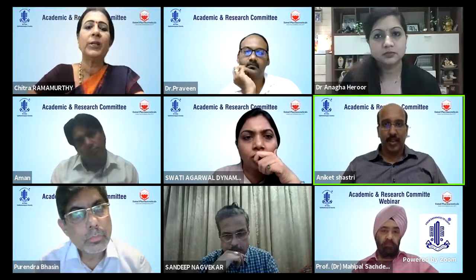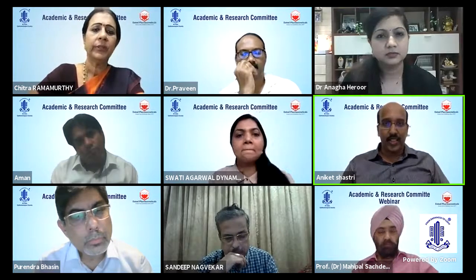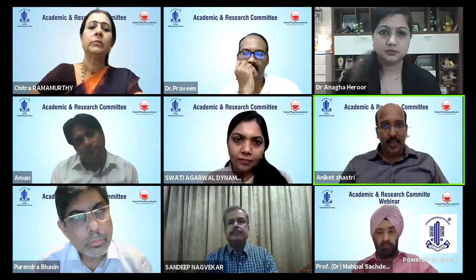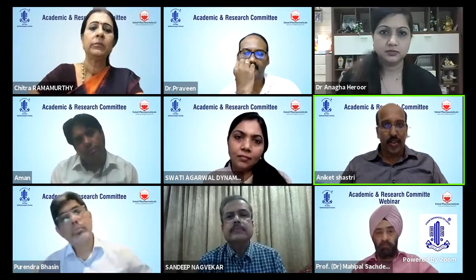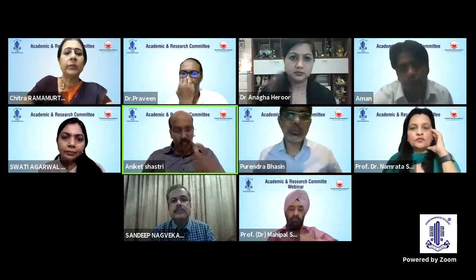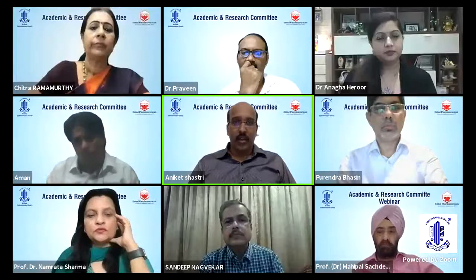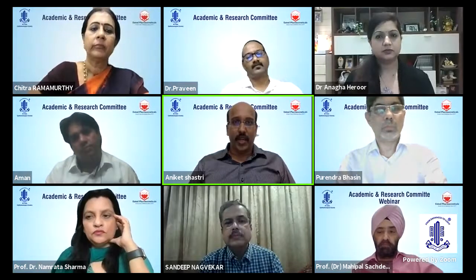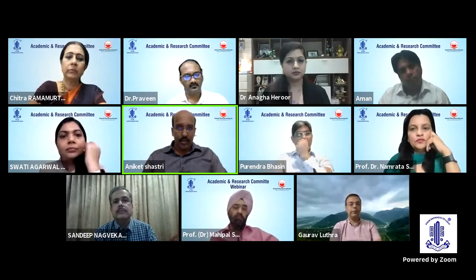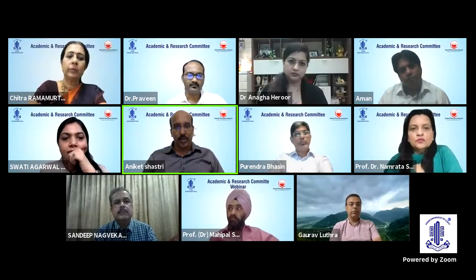Agree, and you did not use tricot. Yes, ma'am. Just before starting the phacoemulsification, we confirmed that there was no vitreous, and only then we started. For the time frame, there were so many points to cover, so for a 4 minute video, I had to cut short many things. In between the surgery, we had to insert viscoelastics a lot of times, after every step, continuously throughout, so that we could maintain the chamber, keep it as flat as possible and avoid vitreous prolapse from that area.